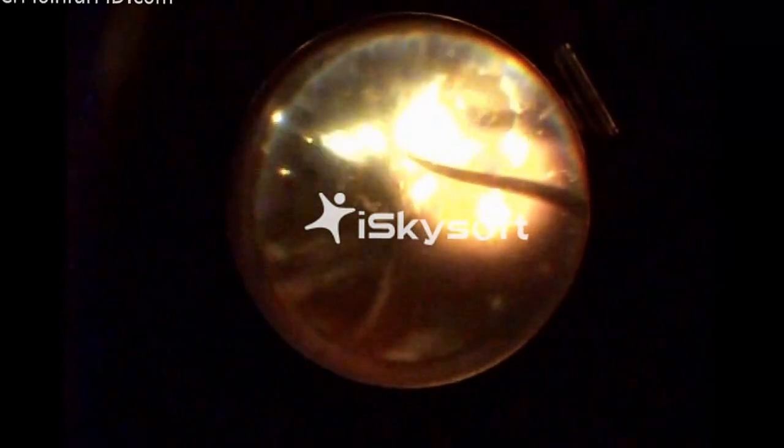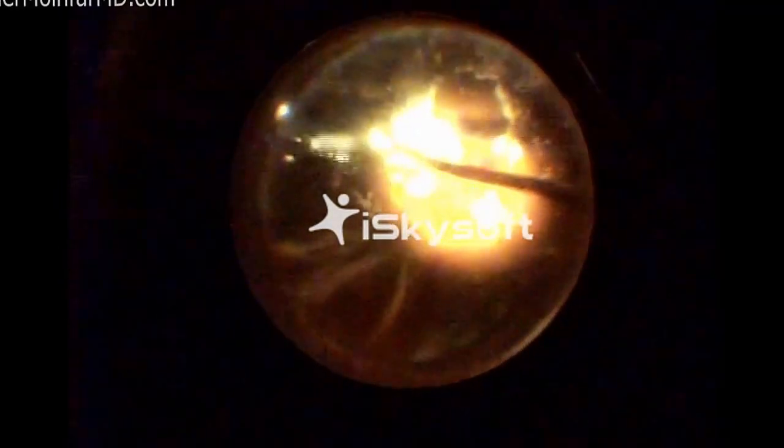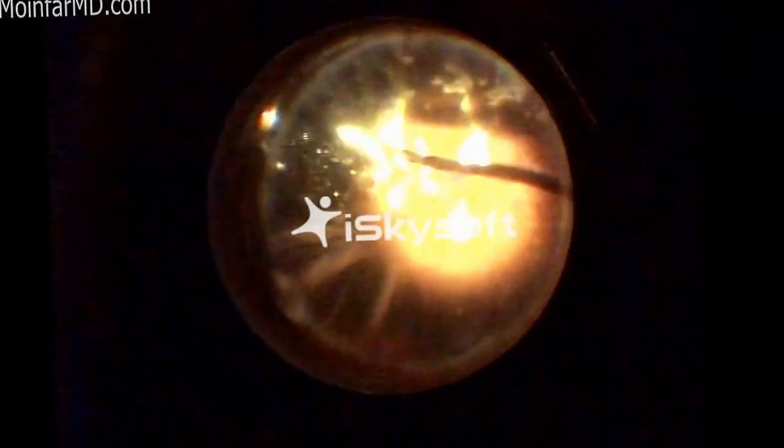Now these wounds are typically not sutured. If constructed correctly, these wounds are self-sealing, and so sutures are not used typically. And leaving an air bubble inside the eye, there's some evidence that it may help reduce the probability of any leakage. So sutures are not used.